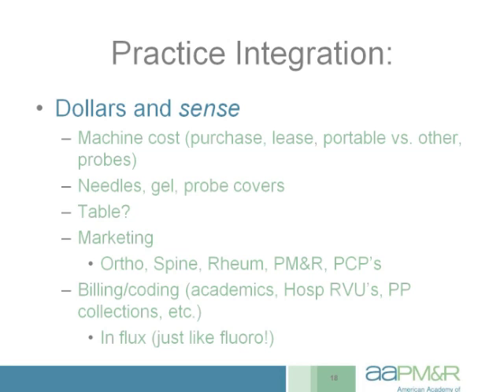There's other things you're going to need, of course, if you're doing ultrasound-guided procedures. The needles are pretty much going to be the same as what you're already using in your office, but you are going to need gel. You're going to probably want to use sterile probe covers and a few other things that you may need to get up and running. I talked a little bit earlier about the table you use. I think it is probably wise to have an adjustable height table just for your own ergonomics and patient comfort.